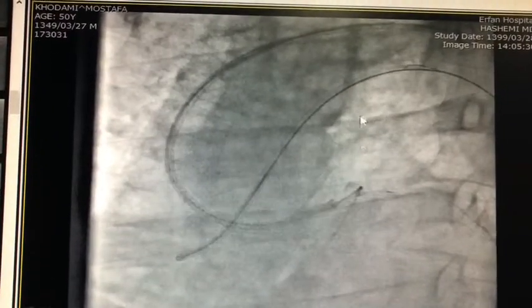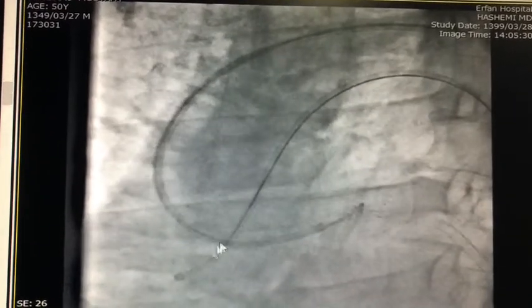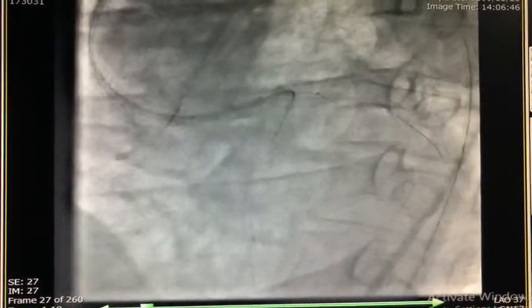and after making sure that the grip is okay, we managed to send the Turnpike LP into the antegrade guiding. At this point, we withdraw the retrograde wire very carefully, and make the loop with RG3, and then we did step predilation.